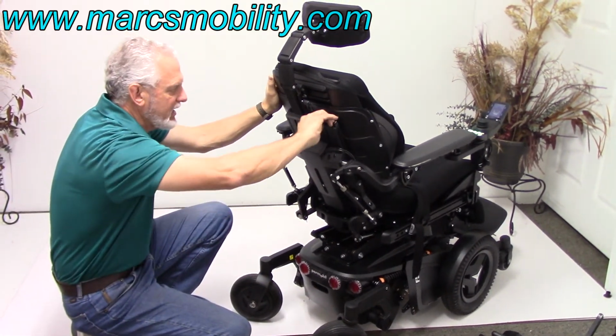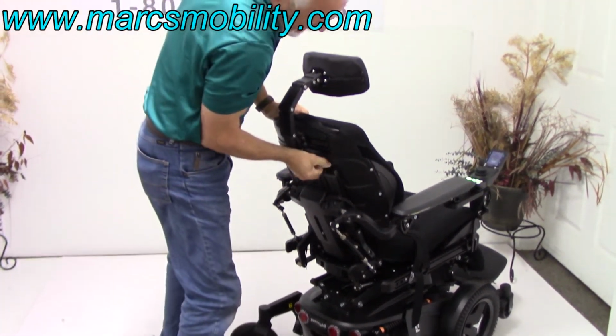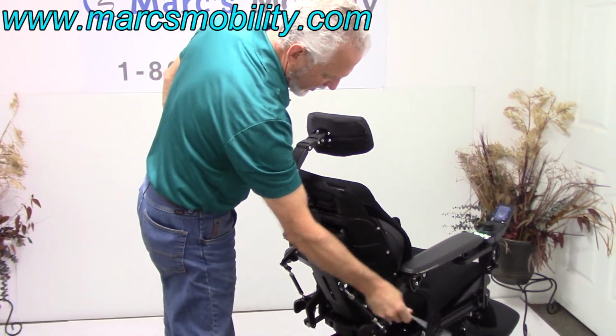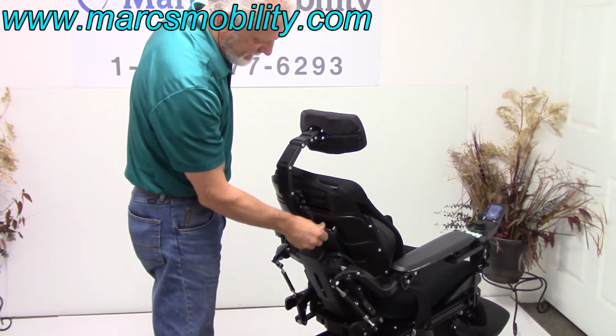You've got a key right here, an Allen wrench key that's sitting in this hole right here that you can use for any adjustment on your power chair. Any adjustment on the arms. So it's right here. It's sitting in there like that.